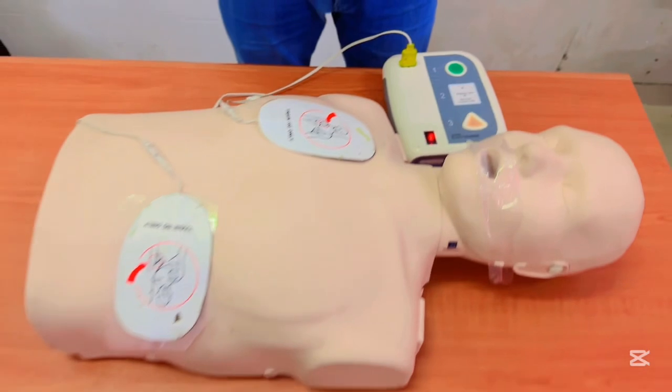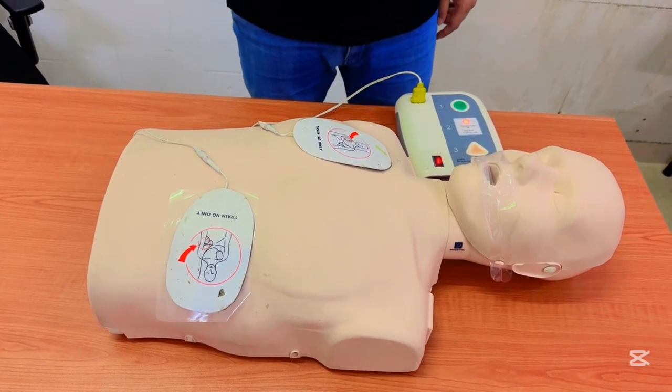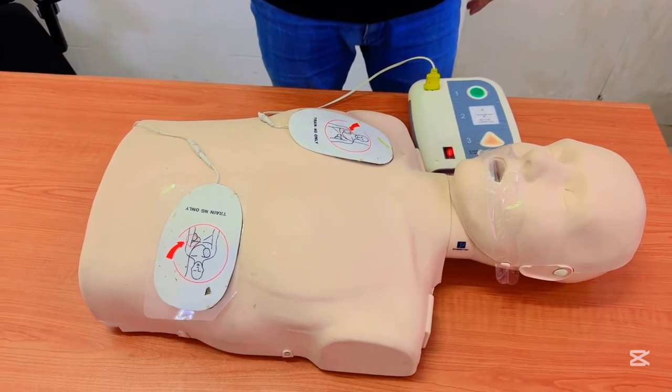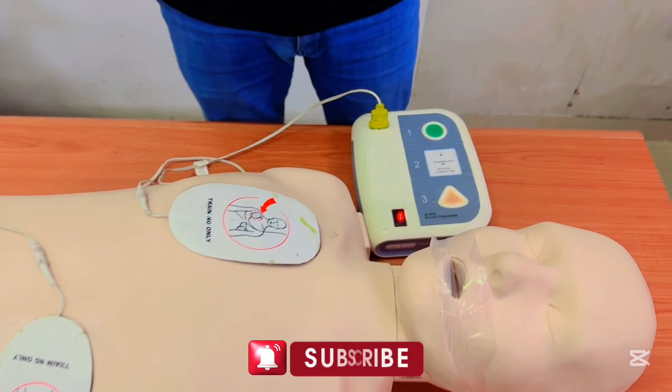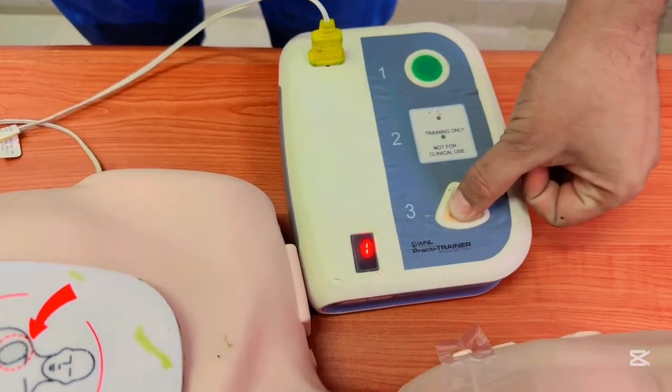AED will conduct an ECG. Don't touch the patient. Nobody should be in contact with the patient when analyzing the heartbeat. Shock advised. Stay clear of patient. Shock now. Press the orange button now. Shock delivered.